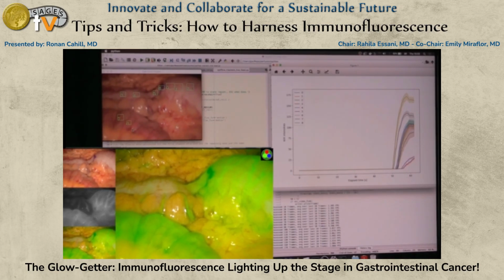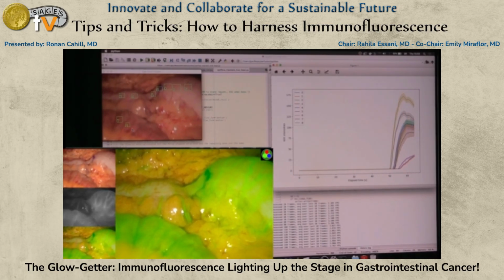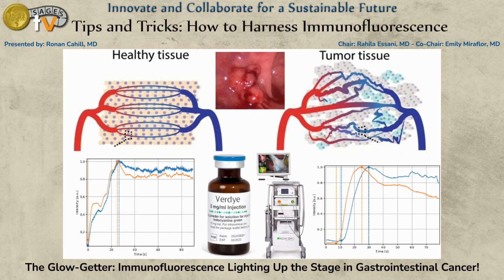So this we think is useful. So vascularity is different in cancers compared to not cancers. There's lots of other differences too, and basically every paper you've ever read tells you that cancer is different to not cancer, but an early hallmark of it is changes in the vascularity. And this dye linked with quantification can exploit those differences in real time.